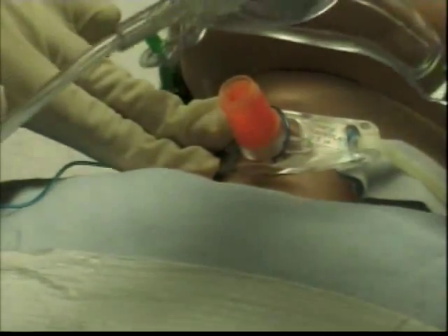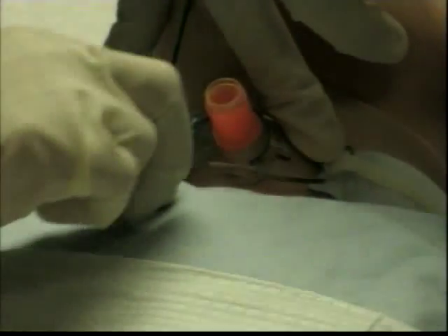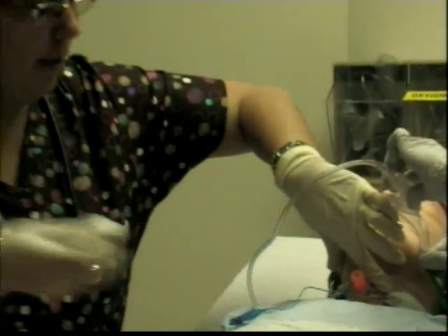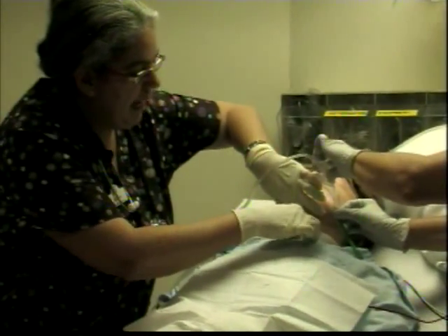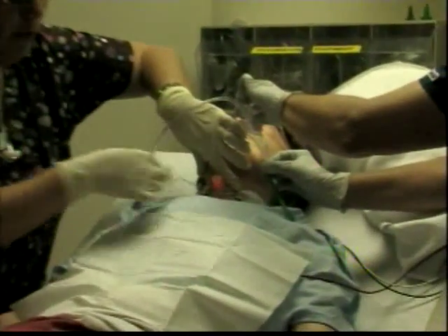The next one comes in here. We're going to the other side. So I'm holding it in place, and I'm just going to clean it, removing all the crusties, and make sure that everything is clean. If we need more, you will have more, and you can just go ahead and clean it and finish it. If you want to have any of the 4x4s to help you clean a little bit, you can do so. You make sure that you just tap. You don't want to be rubbing back and forth. You just want to dab and remove.